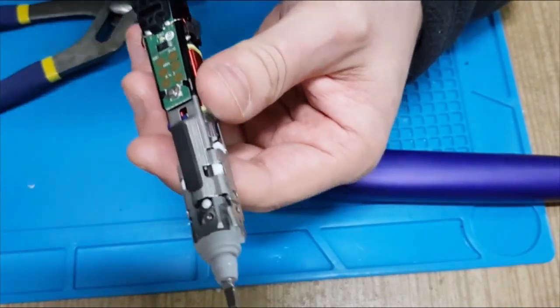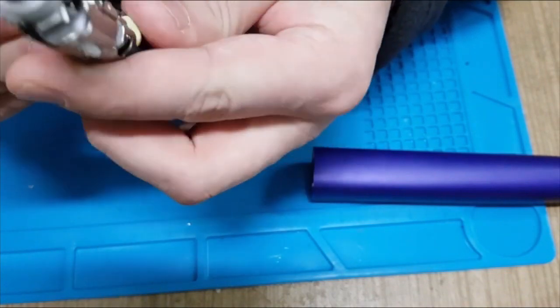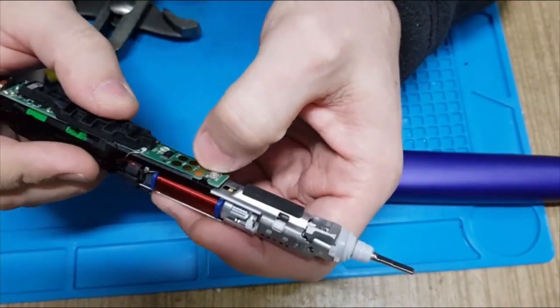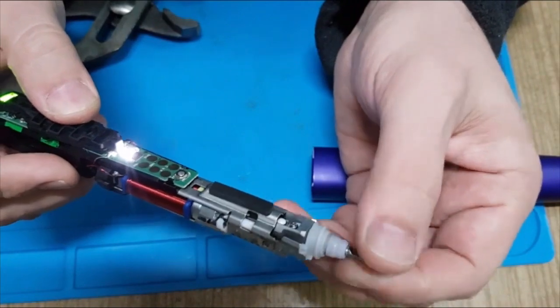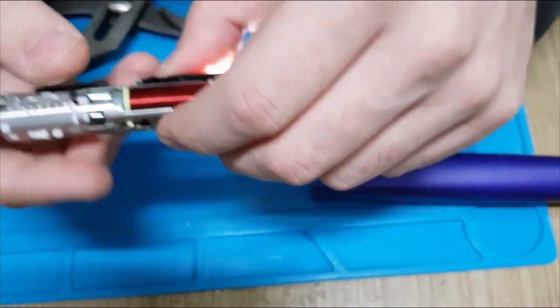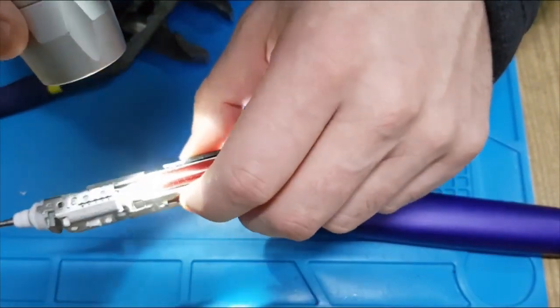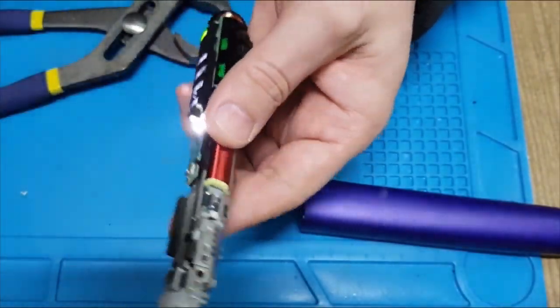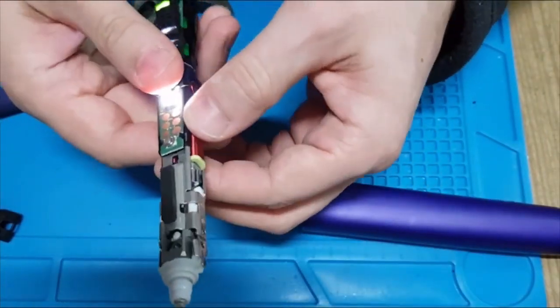I just noticed that the button is slightly offside, but it functions quite well. Let's see. It has some of the sound, so maybe we could make the space bigger. Yeah, we can just do it a little bit bigger. Yeah, I'll do it offline without wasting your time.